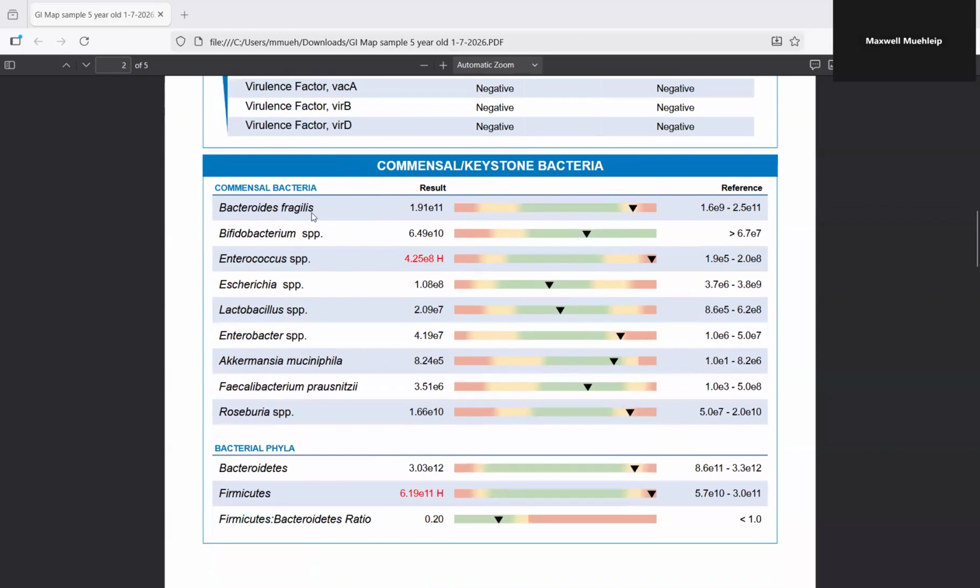These are bacteria that are generally very helpful for digestion and for gut health. If they're overgrowing, like the Enterococcus species here, or if they're not in enough abundance, there can be an imbalance in the microbiome. Keystone in that they're usually serving a beneficial function and found in a lot of healthy microbiomes of people with a nice healthy gut and a large diversity of microorganisms. Enterococcus, when that one overgrows, it can create symptoms of bloat or irritable bowel, which is changes in regularity and can be related to gas and abdominal pain, which this patient certainly has.